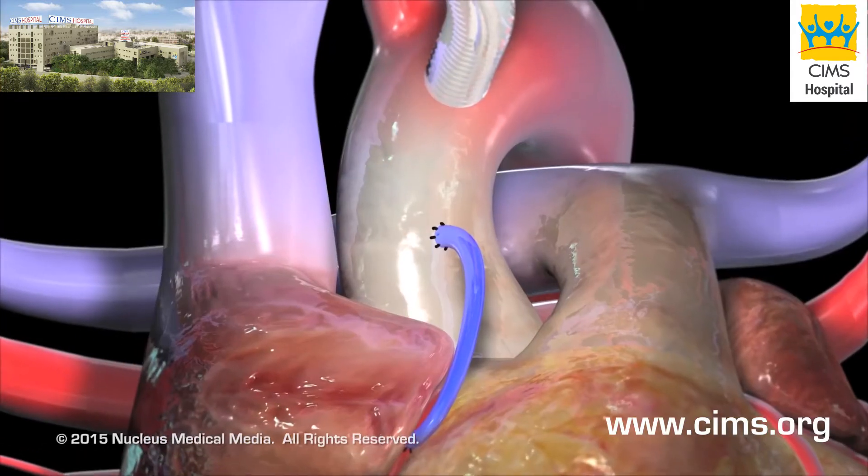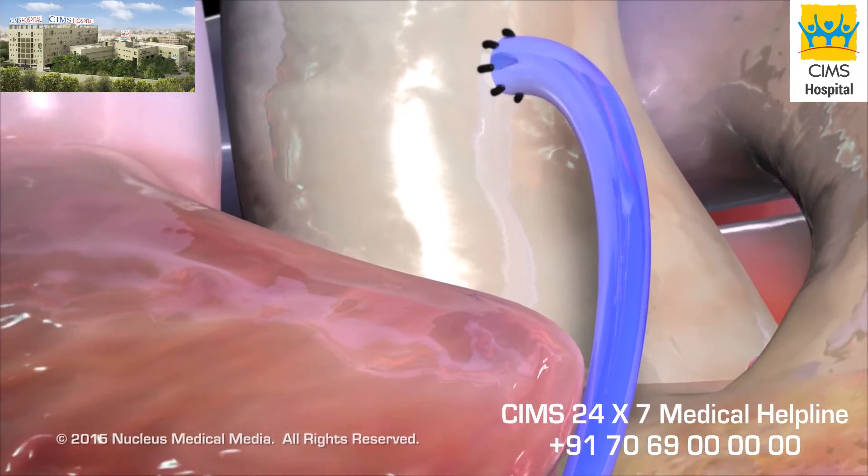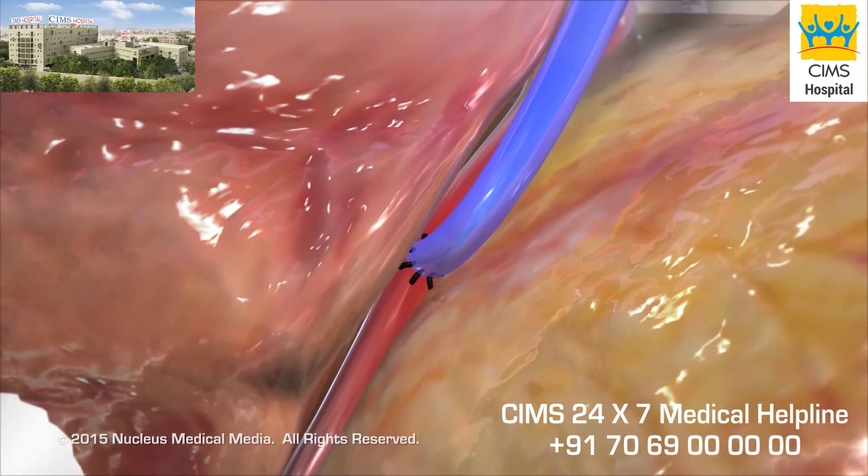For the saphenous vein graft, your surgeon will suture one end to the aorta and the other end to the narrowed artery just beyond the blockage.